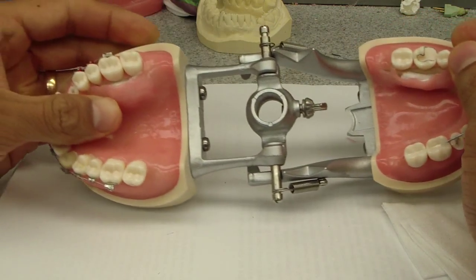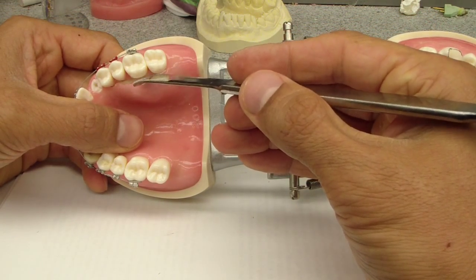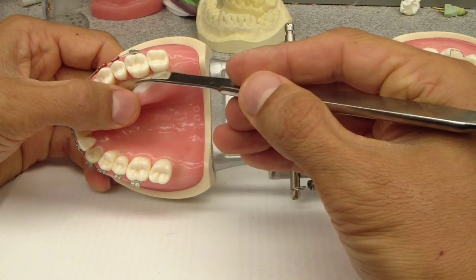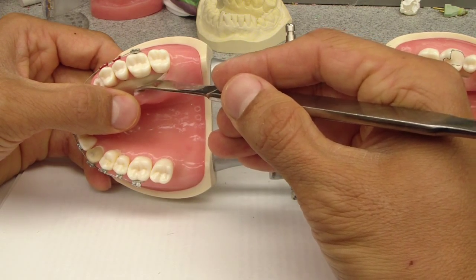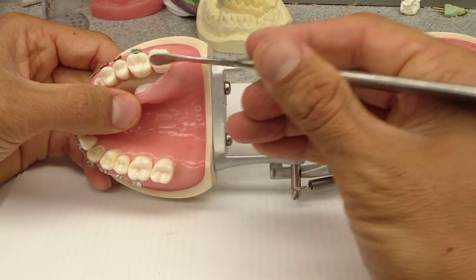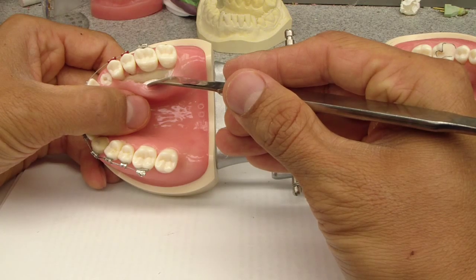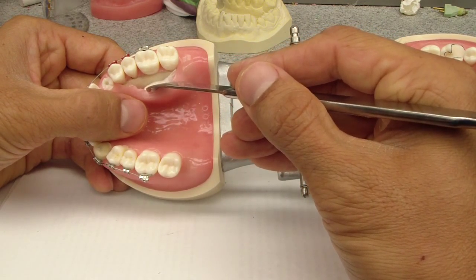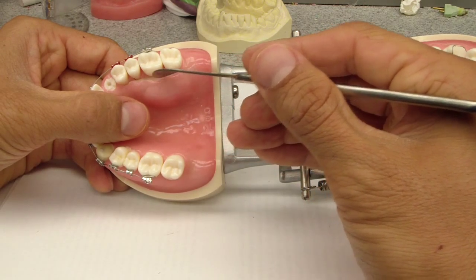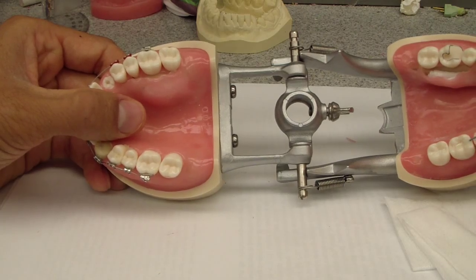That was one of the neat tricks I learned from him. So thank you, Dr. Latte Ice. Placing gauze underneath, especially on the palatal, not only provides some hemostasis, but it also keeps the tissue elevated so that when you go to remove it or when you're doing your procedure, the tissue is elevated away from the bone. And when you go to remove it, it sort of expands the tissue and the tissue stays there.